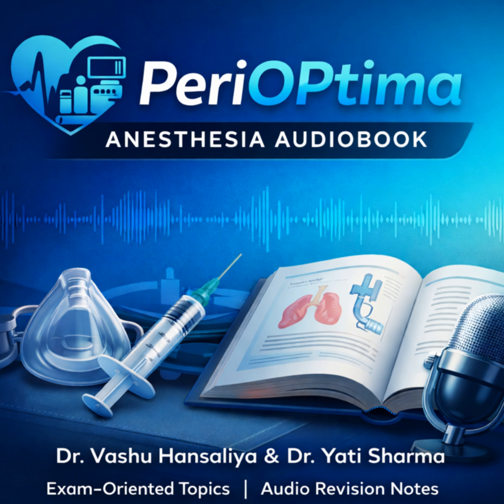Let's switch modes entirely and anticipate the questions coming from the senior faculty across the table, the key facts that just have to roll off the tongue instantly. Okay, here are the frequently asked VIVA questions that are aimed at rapid conceptual recall. First, define CICO and where exactly does the SGAD fit? And the answer? It is the mandatory rescue oxygenation step between failed intubation and ventilation and invasive surgical access like a cricothyrotomy.